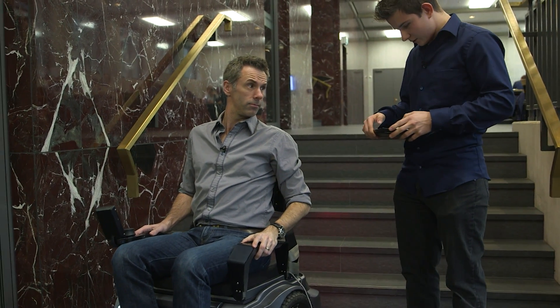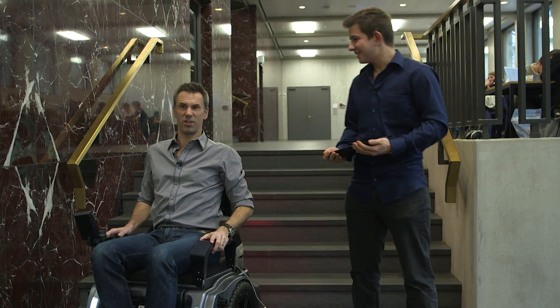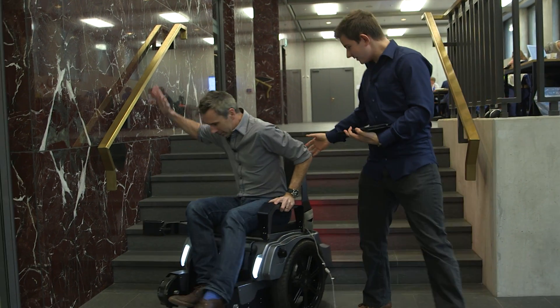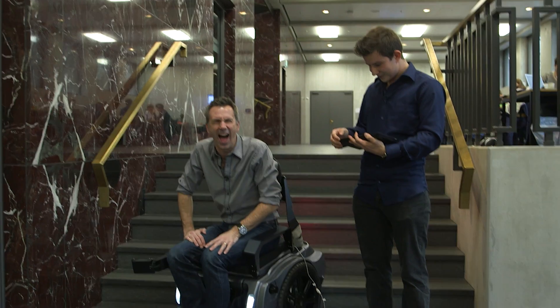And now I press... oh no, I pressed the wrong button. It shut down. It shut down. Well, I'm so happy we're about to go up some stairs.